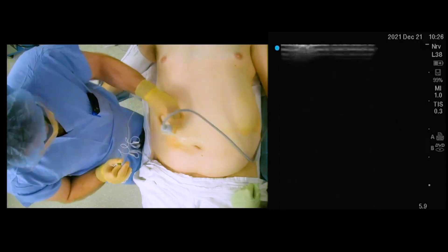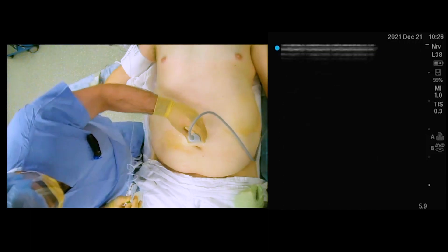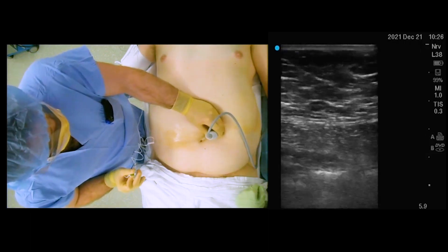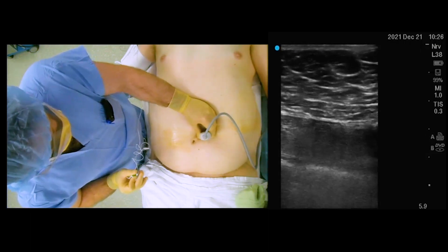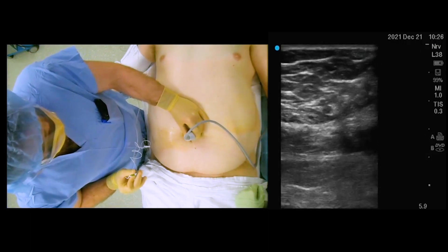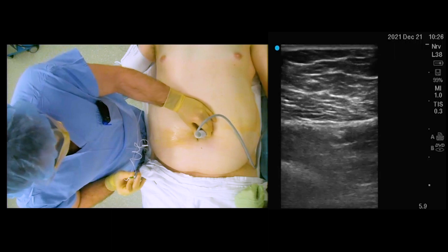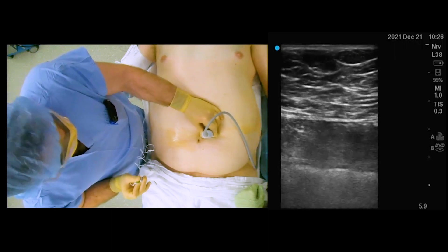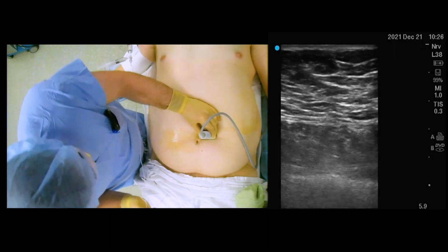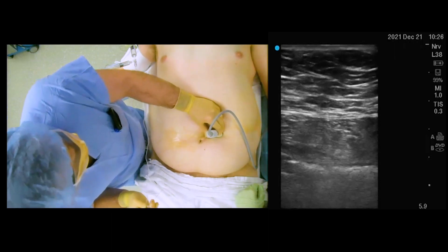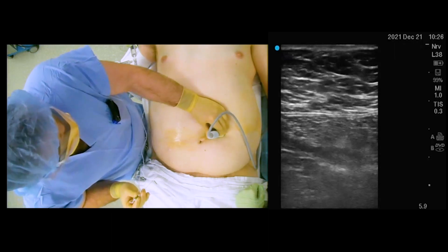The choice for these blocks was to help facilitate pain control for the ventral midline incision that would soon be coming. This was repeated on the other side.